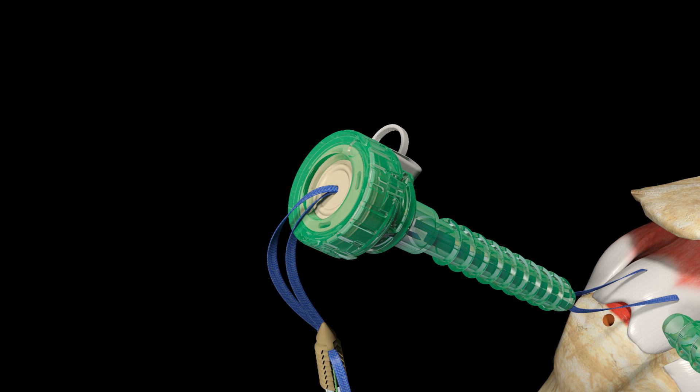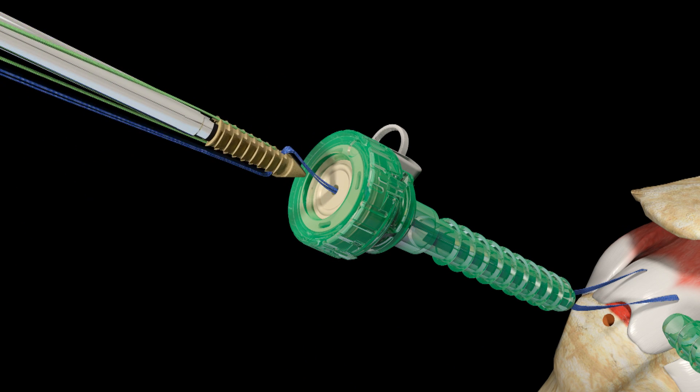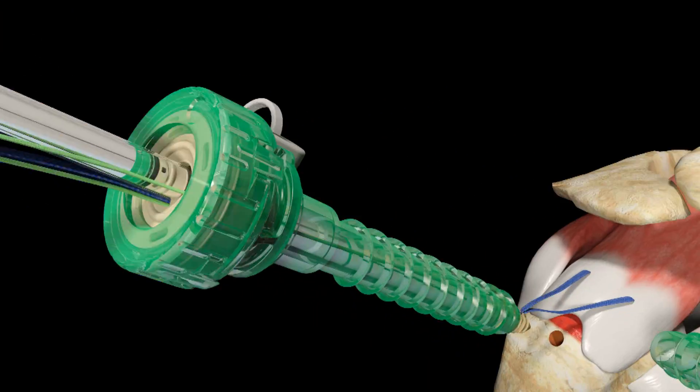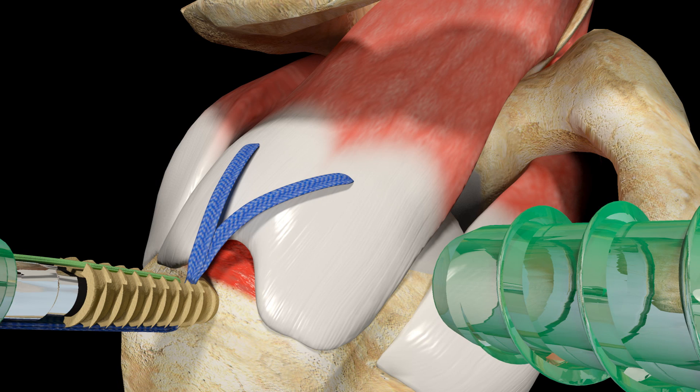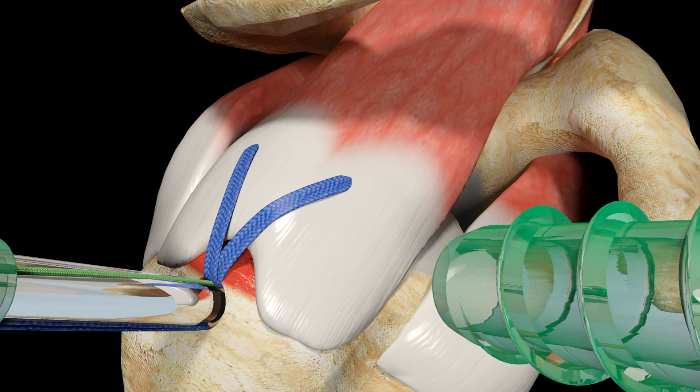Remove the awl and remove the hemostat. Taking up a small amount of slack from the Ultra Tape Suture limbs, introduce the Footprint Ultra PK Suture Anchor into the lateral cannula, taking care not to twist the sutures. Position the anchor over the prepared pilot hole, aligning the eyelet so that it faces the tendon where the suture limbs enter the anchor. Using a mallet, tap the Footprint Ultra PK Suture Anchor into the pilot hole, ensuring that the black laser line is flush with the bone.